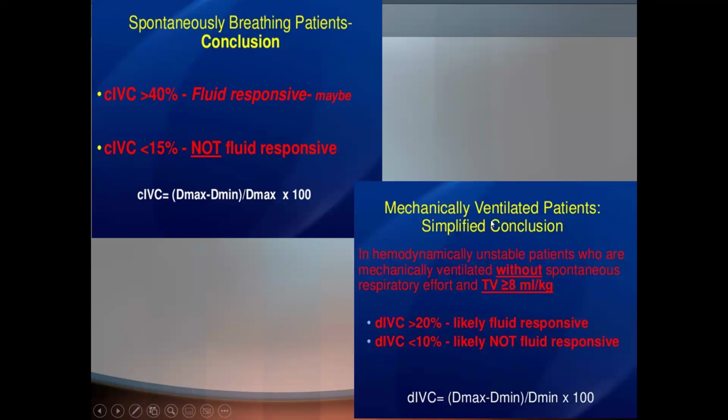For the distensibility index, you have to be cautious during mechanical ventilation. The patient has to be sedated, with a tidal volume of 8 ml per kg or more.